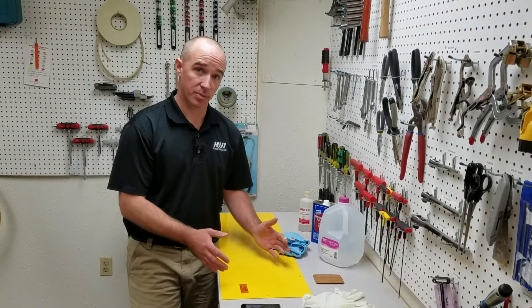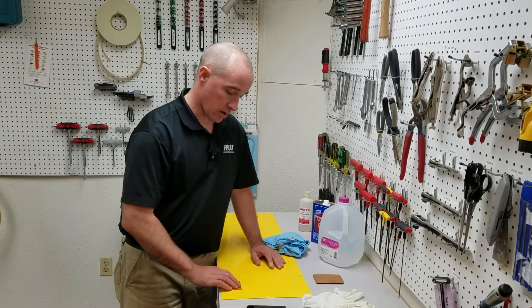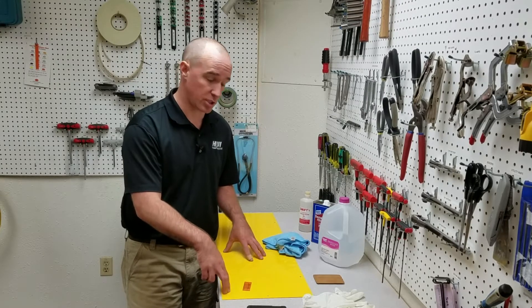The Marking Durability Test is a pretty simple and straightforward test. The equipment we need is a timer, our decal that we're going to test, and the substrate that we're going to apply the decal to. In this case, we have powder coated sheet metal.